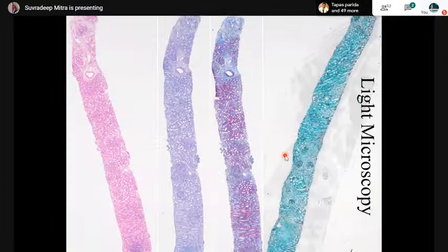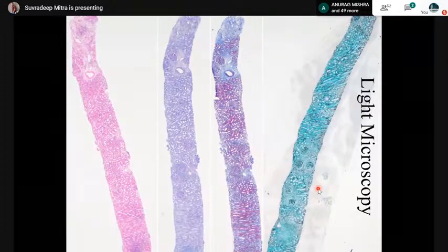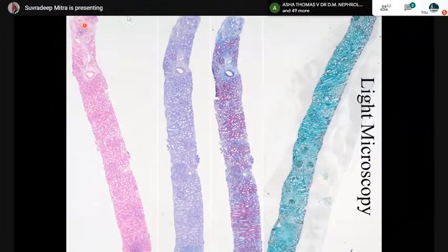So when we look at the renal biopsy, we tend to stain it for four stains. Other than the hematoxylin and eosin stain, which is the routine stain, at least you should have one PAS stain. It's extremely essential to have a PAS stain as well as a Masson trichrome stain. It's really good if you can have a silver stain in terms of methenamine silver, usually Jones methenamine silver, and this is how the cores look like in the low magnification.